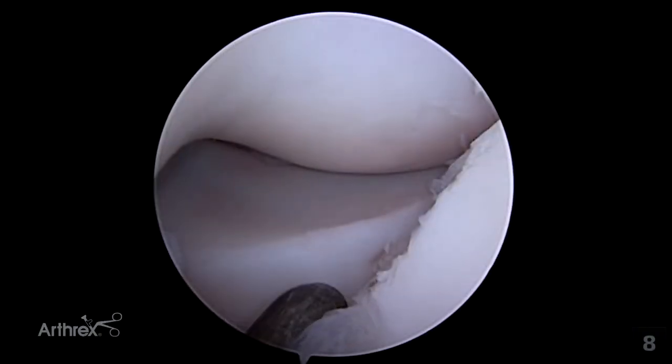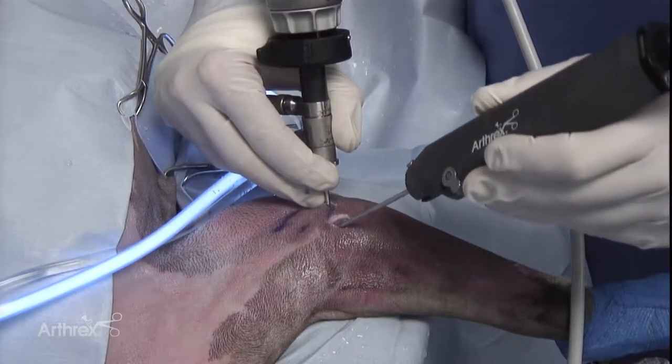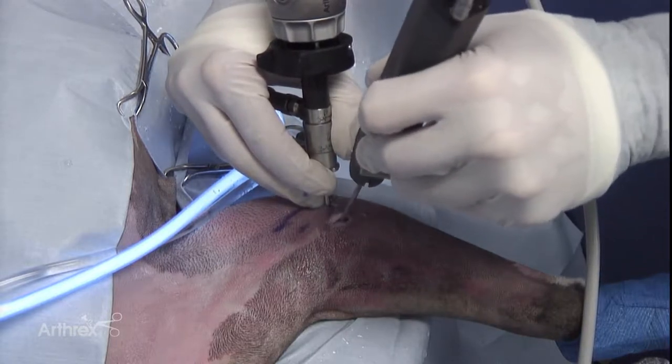The performance of the biceps ulnaris tendon release can be performed intra-articularly at this point by placing a shaver into the location of the subtotal coronoidectomy.